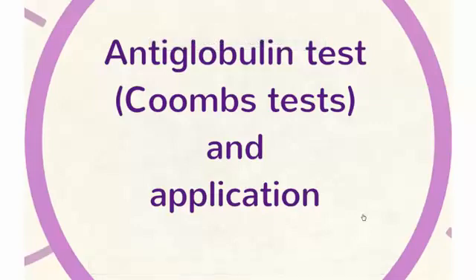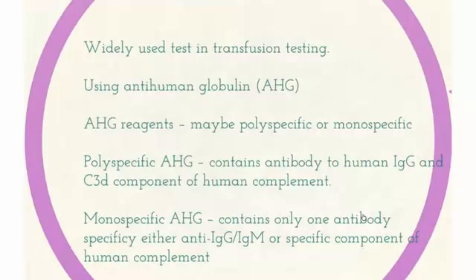This is a very short topic on antiglobulin test and its application. Antiglobulin test is also known as Coombs test. This test is widely used in transfusion testing, and we use anti-human globulin as a reagent.